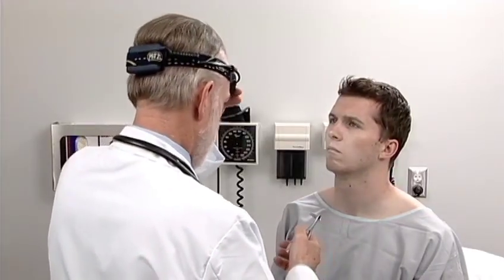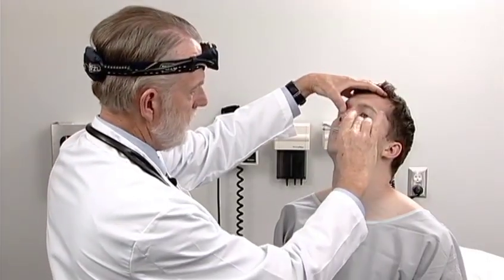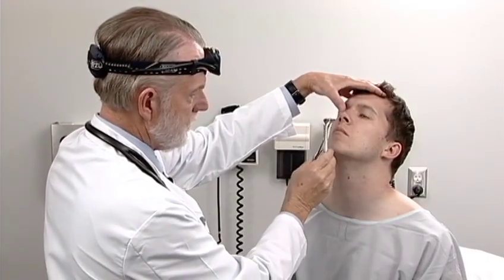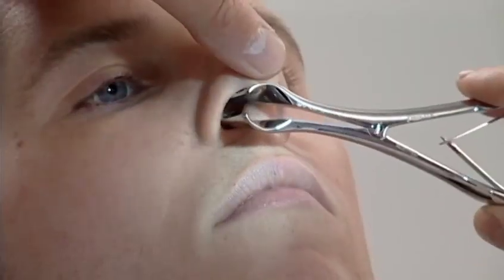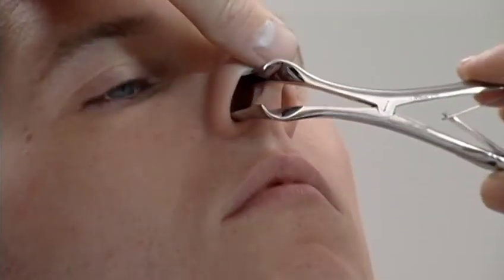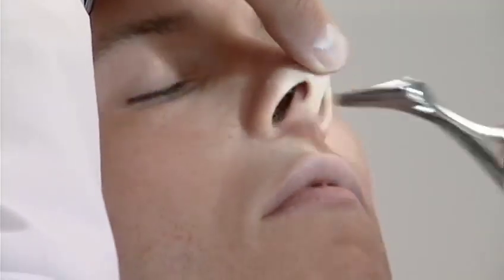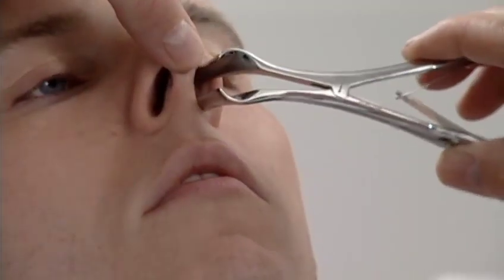So to use the nasal speculum, you have a good light. And again, you tilt the head back. And the speculum goes in this way. Again, you do not want to do this, as that will run up against the septum and be quite uncomfortable. And this allows you to really give a very good view along the septum and then along the lateral wall and the turbinates. If you're going to approach epistaxis, it's virtually essential to use a nasal speculum to identify the bleeding points and get control.